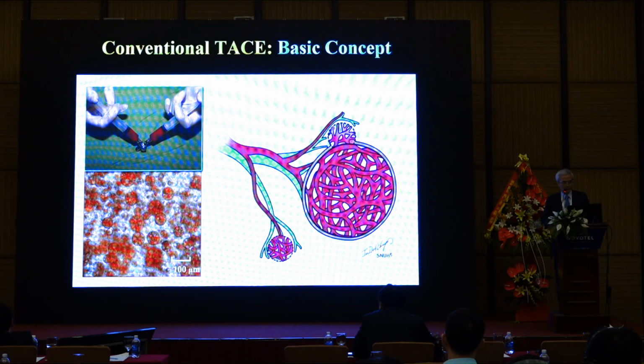And you can see a blue color around the extracapsular invasion part and early HCC. It means that there is a certain proportion of persistent portal venous supply.